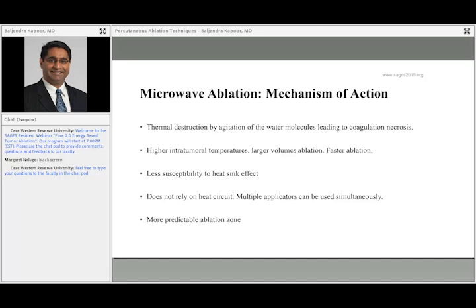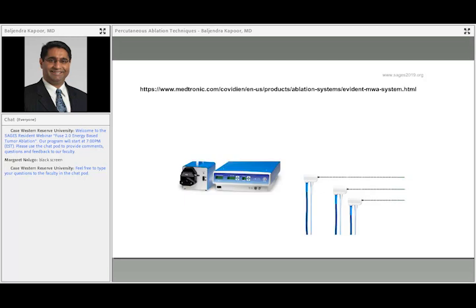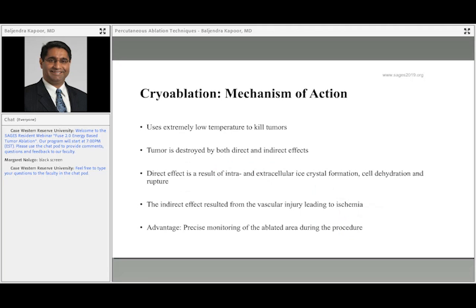Microwave ablation, I'm just going over the different mechanisms of action of these devices. Microwave ablation causes thermal destruction by agitation of water molecules, leading to coagulation necrosis. It leads to higher intratumoral temperature, larger volumes, faster ablation, and less susceptibility to heat sink effect. Since it does not rely on heat circuit, multiple applicators can be used simultaneously, and it produces a more predictable ablation zone. And here is an example, this is the Medtronic system that we use for microwave ablation.